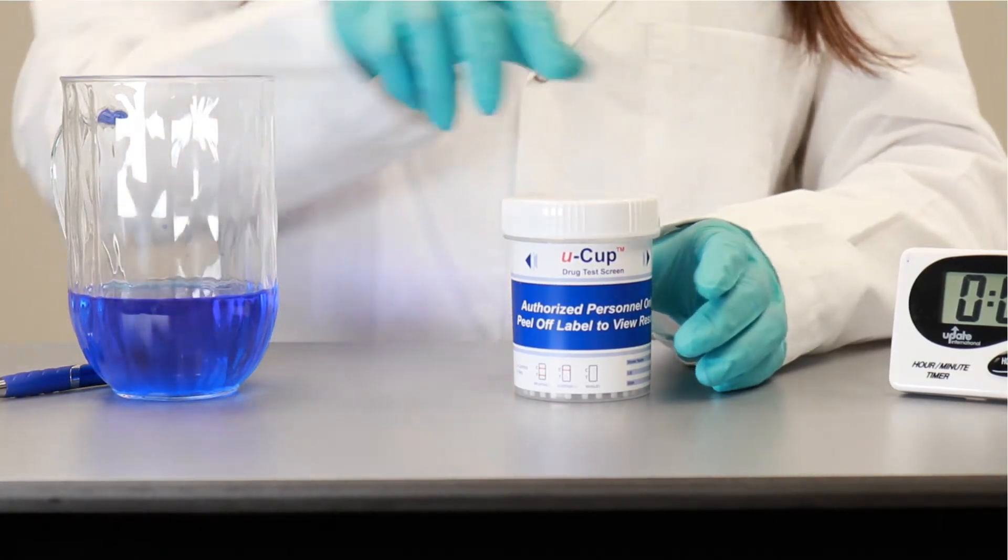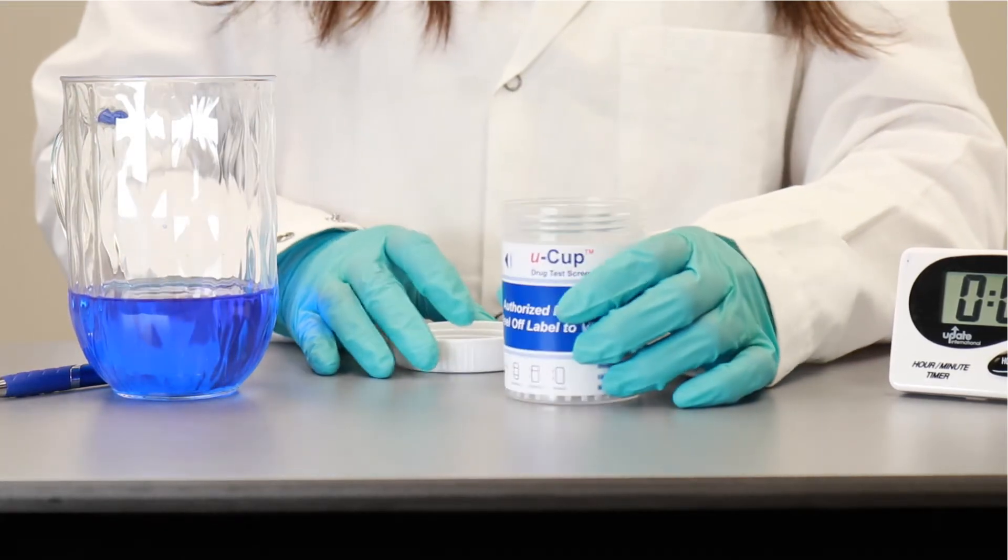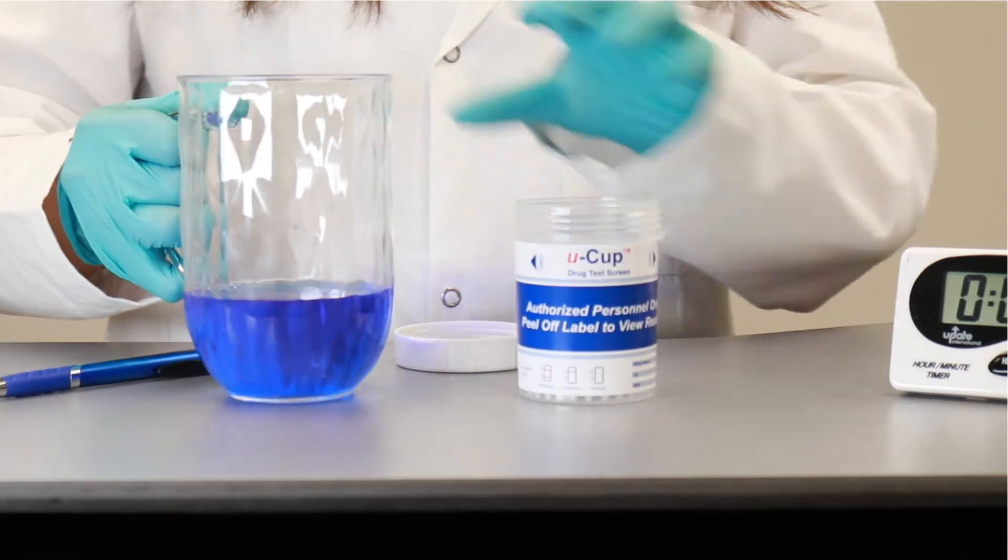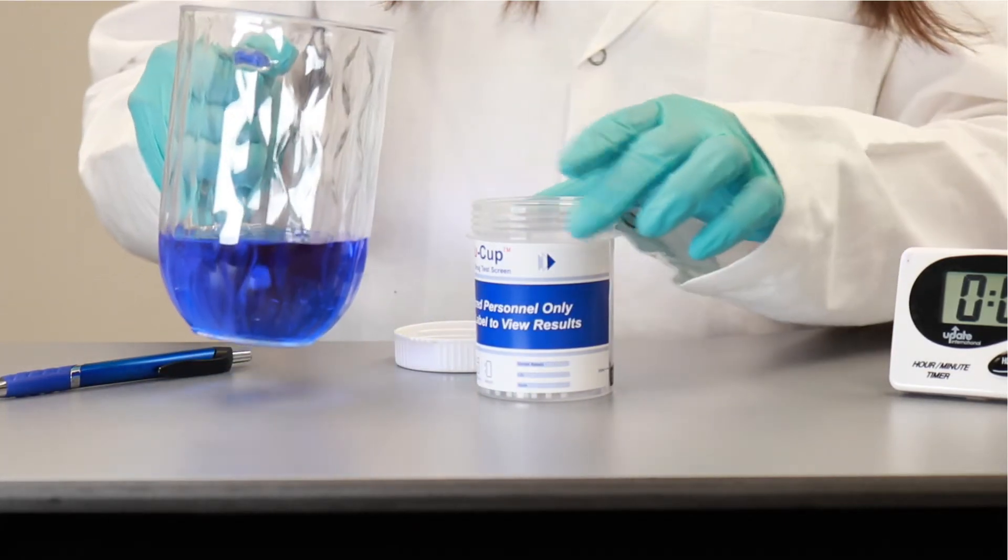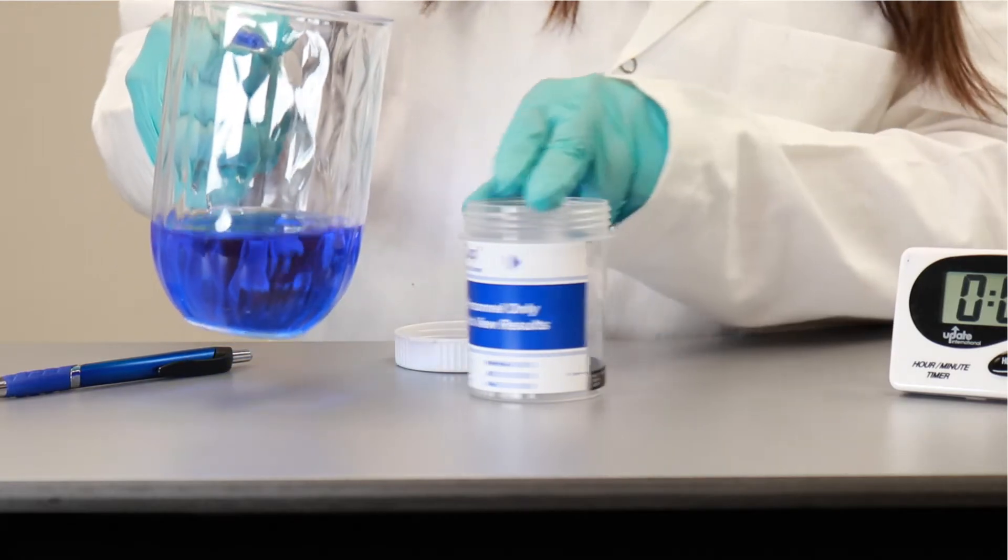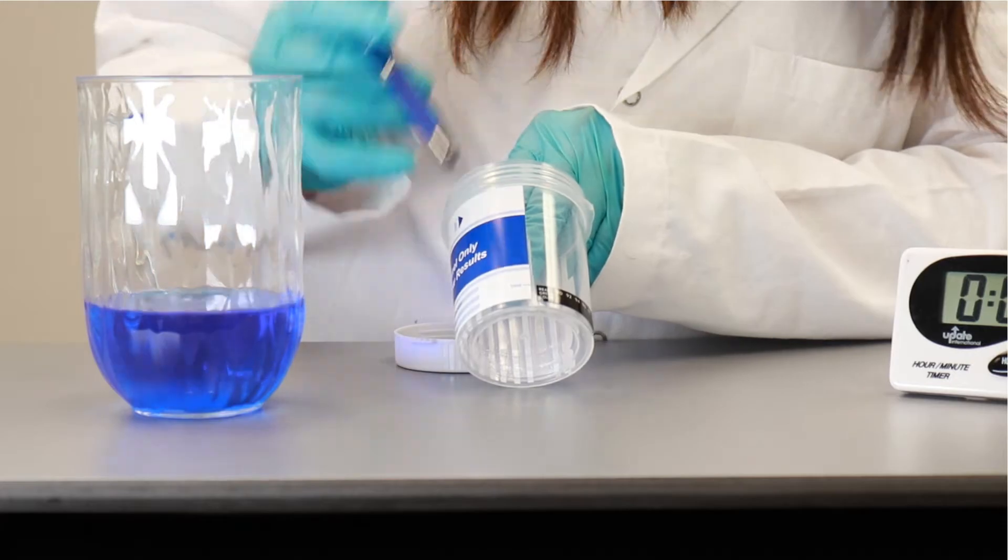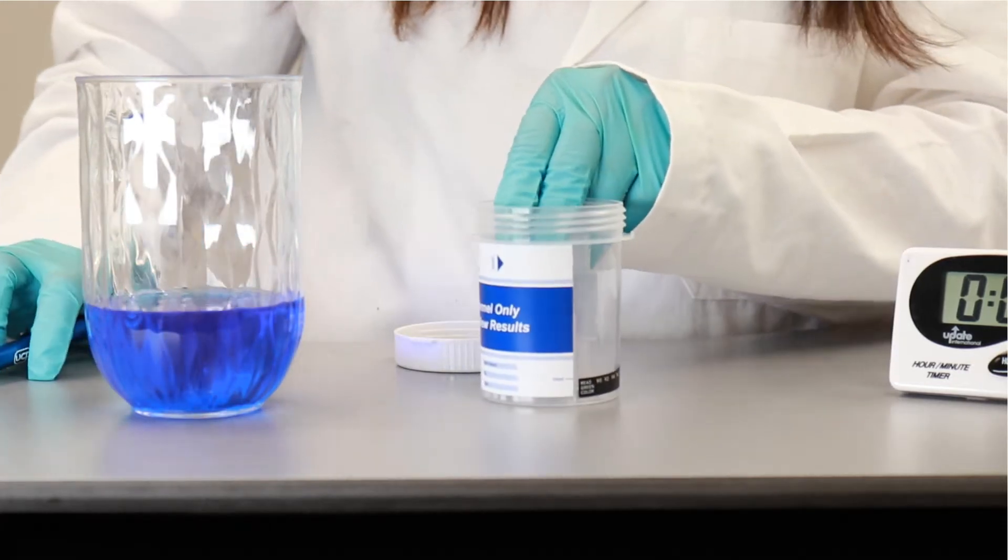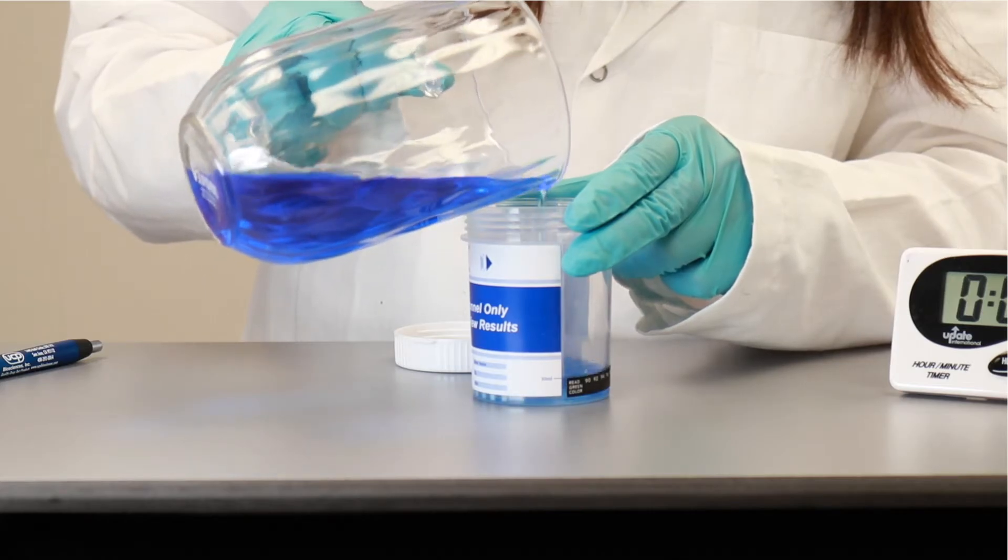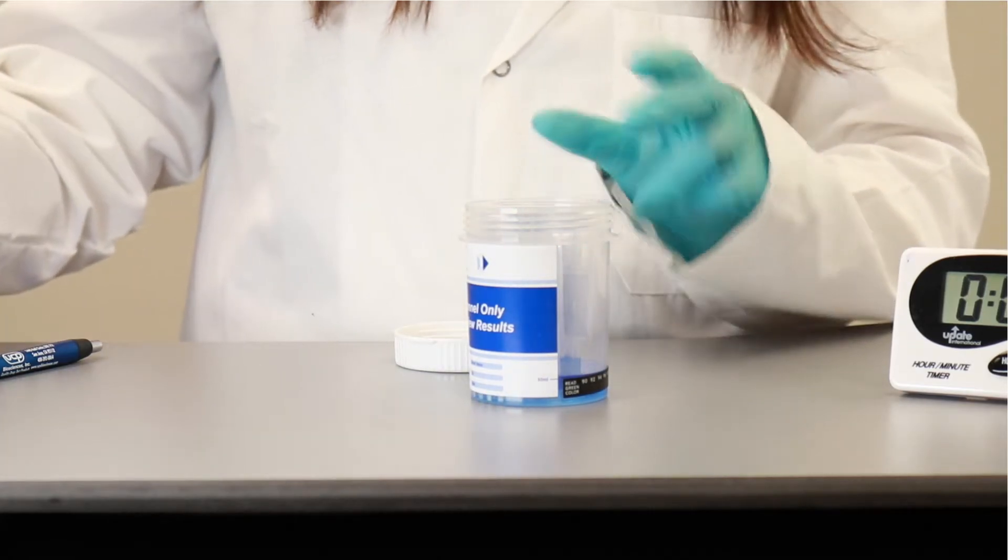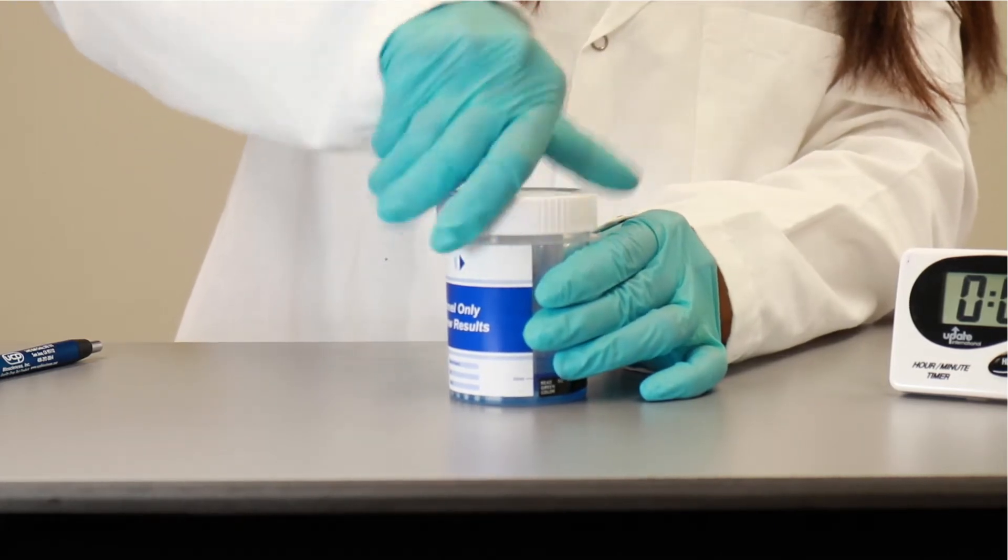So what we are going to do now, we are going to open the lid. This is the sample that I have prepared. It's a colored water sample, just for the instructions. We are going to add this sample to the 30 milliliter mark. So if you can see right here, there is a 30 milliliter mark. I am going to add just enough sample in here, and close the lid all the way, seal it.